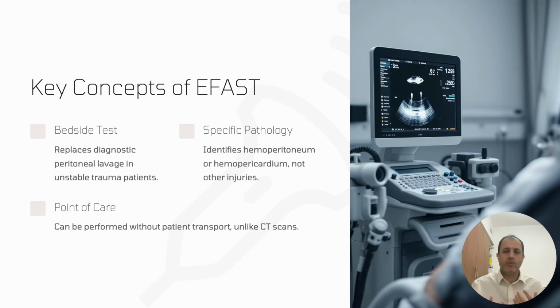You just need to be familiar, practice, have some training, and do some case studies under observation, and you will get the skill to do this easy ultrasound examination and help the patient. So there is no need to transfer the patient to other departments.